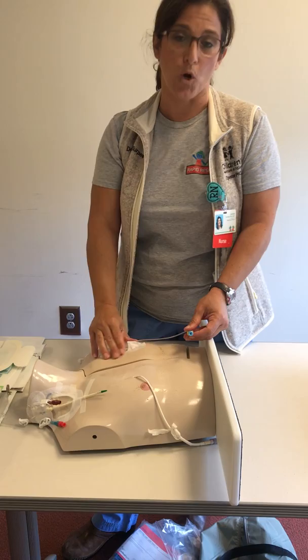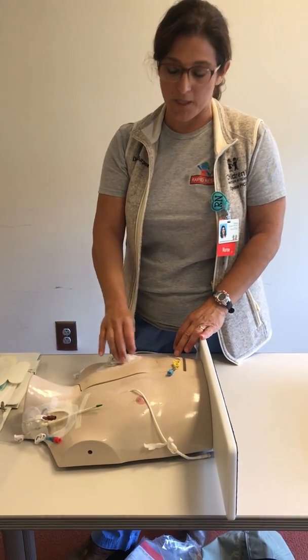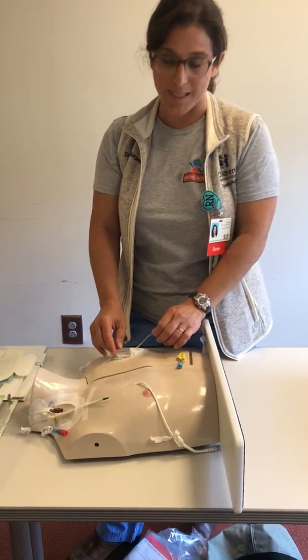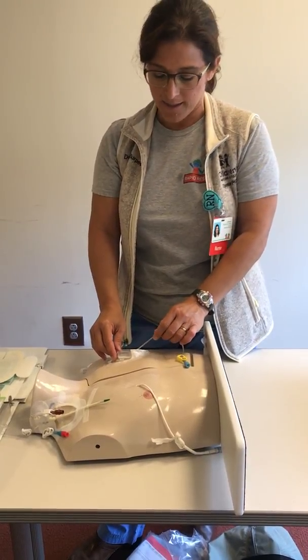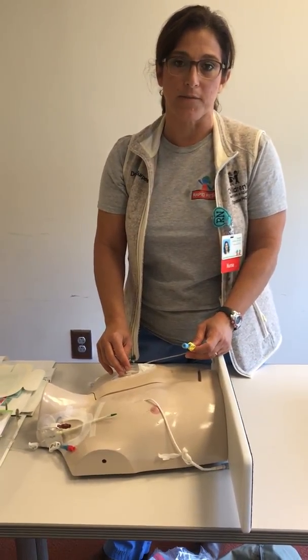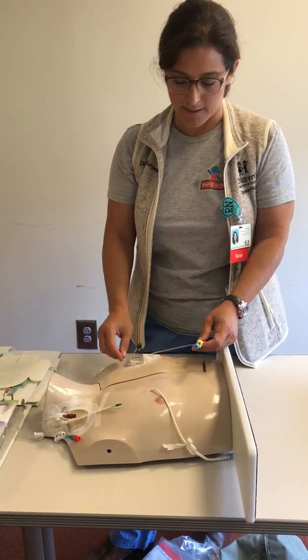Whenever you have a port in, before you de-access it, remember these dressings are only good for 7 days. Sometimes the dressings get changed within those 7 days, so it's real important to go into Epic and find out when it was last accessed. It should be re-accessed every 7 days, even though the dressing was just done a couple of days ago.